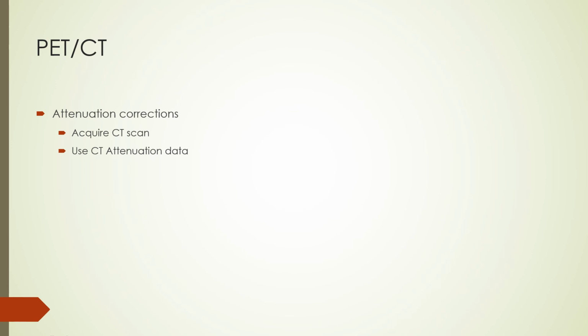Usually the CT scan precedes the PET scan, and the quality of the CT image required depends on the CT technique used in the X-ray system and the time taken for the scan. It should be noted that the radiation dose to the patient from the CT scan may be comparable to that for the PET scan. The effect of the energy difference between the photons from the CT scanner and the photons from positron emission is corrected prior to applying the CT-derived attenuation correction.